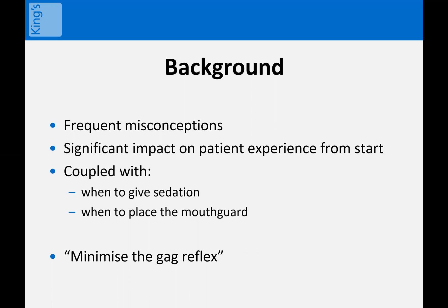The point of throat spray is to minimise the gag reflex by diminishing sensation. But this in itself can be an extremely disconcerting experience for many people, so it helps to let people know what's coming. I have a script that I follow once I've given the first set of sprays, and more of that as we go on.